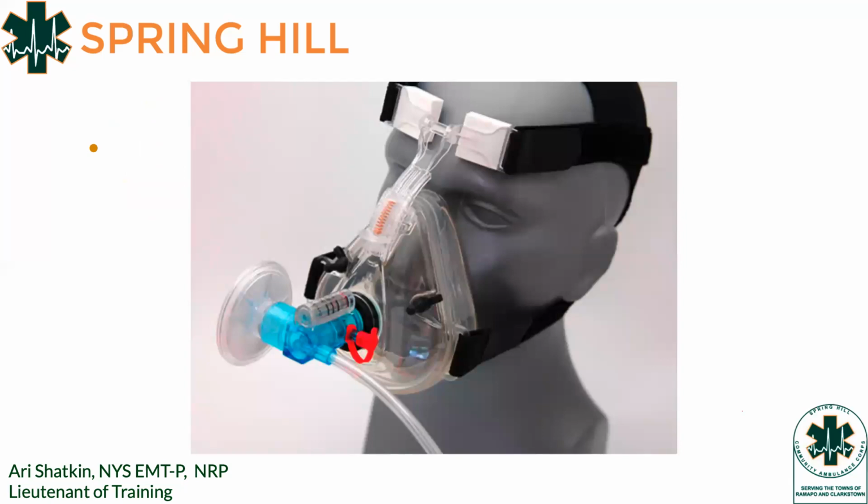And this is a picture of the device up close. All right, so it's really broken up into a few systems. We have the headpiece over here, the mask, and this is going to be your pressure gauge and what's providing the pressure. And this is just a filter that's filtering the air that's breathing out. Ours has a little green knob that we'll go over, and this is a red knob. The red knob is used to provide additional oxygen.